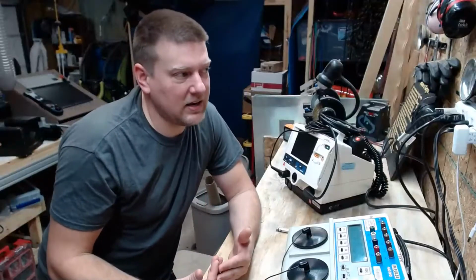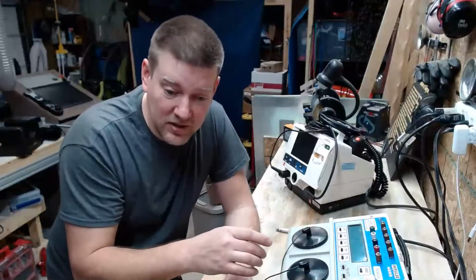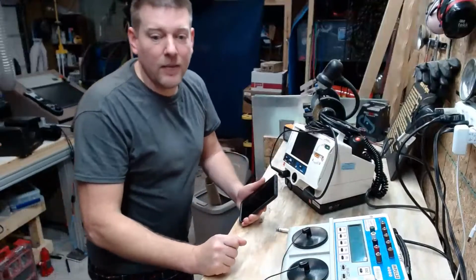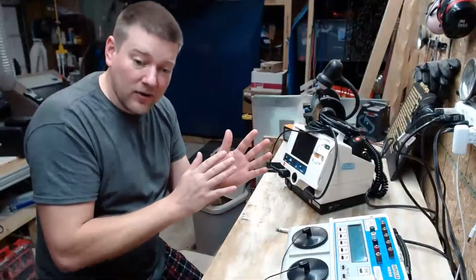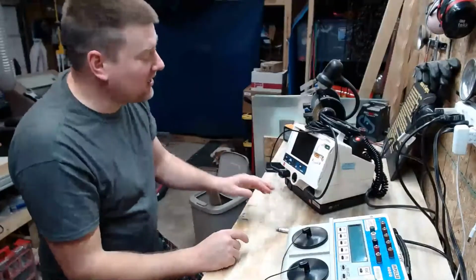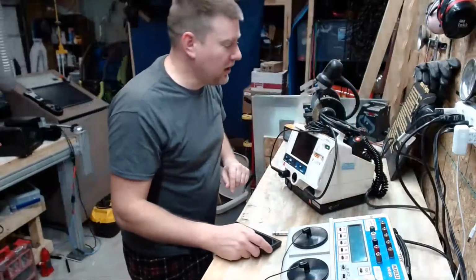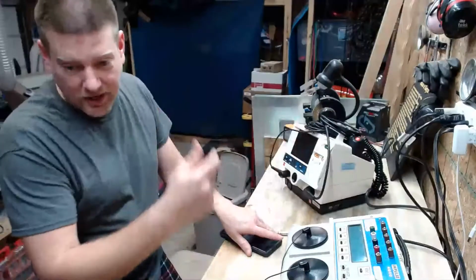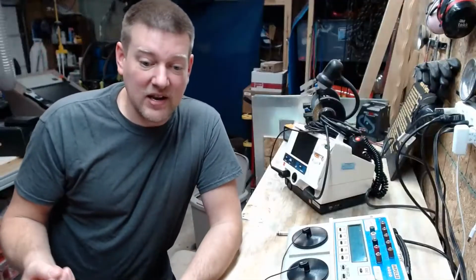But this is our way of combating that. You, as a good biomed, should be taking photos. If somebody smashes a piece of medical equipment, you should take a photo of the damage and attach it to your work order. When something's repaired and it comes back from the manufacturer, you take that printout, scan it in, and attach it to the work order. You document everything that you found when you walked up. Cable was damaged, battery was low, unit wasn't plugged in. You could say you found some pitting on the electrodes, or that consumables were out of date because the expiration date's off.